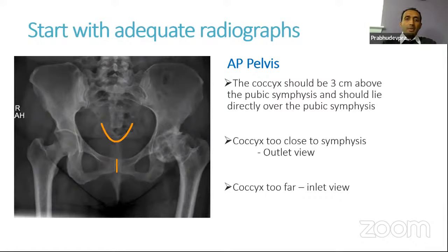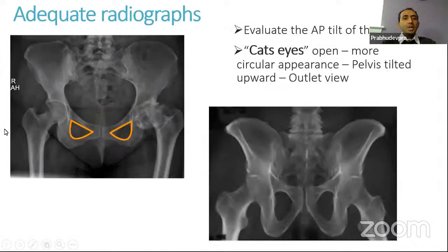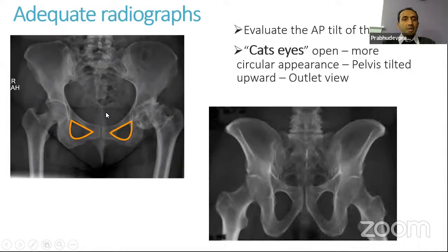If the coccyx is too close, that gives us an outlet view, and if it is too far away, it gives us an inlet type of view. This is how a good quality AP pelvis X-ray should look — the obturator foramen should be symmetrical, not too closed or too open, and the coccyx is centered with the pelvis not rotated. In an outlet view, you can see the coccyx is almost completely covered by the symphysis pubis, which is extreme — we should avoid X-rays like this, as the obturator foramen will appear really open and elongated.